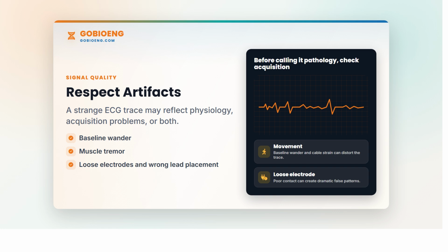Modern healthcare uses remote ECG in ambulances, telemetry wards, home monitoring, wearable devices, and cloud-connected health systems. The question is no longer only, what is happening now? It is also, what happened during the patient's real day?